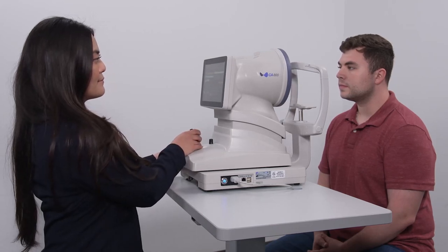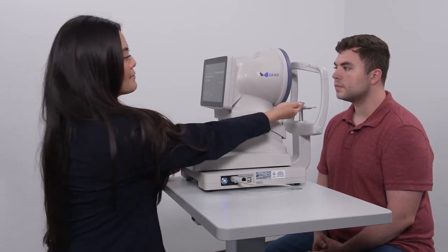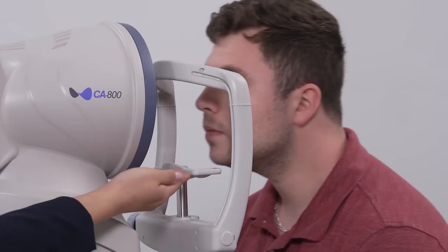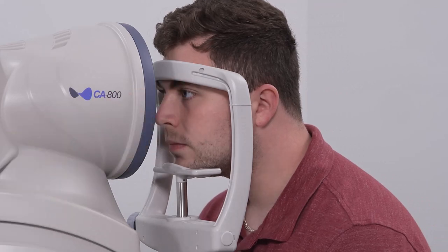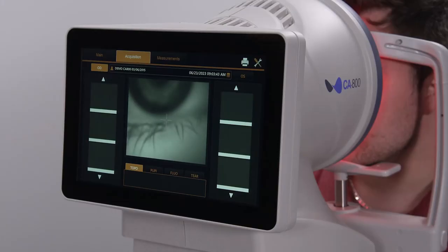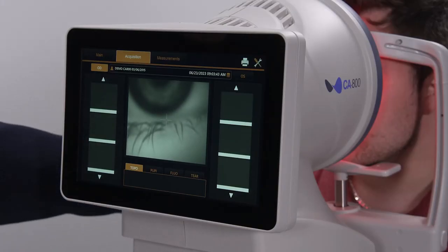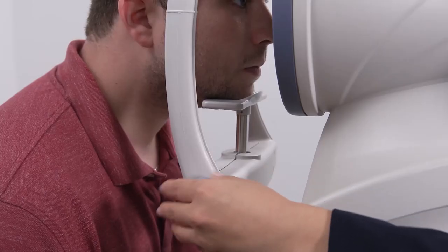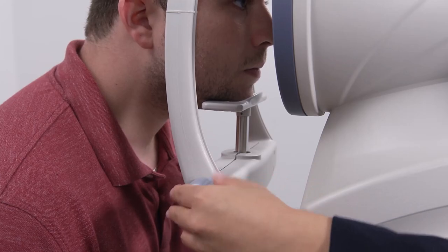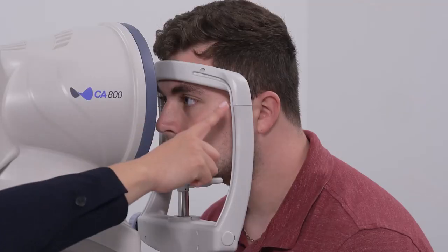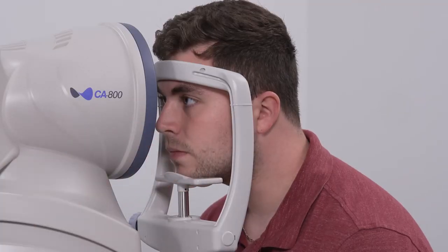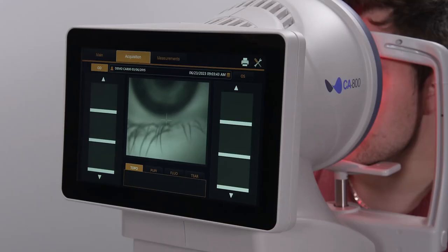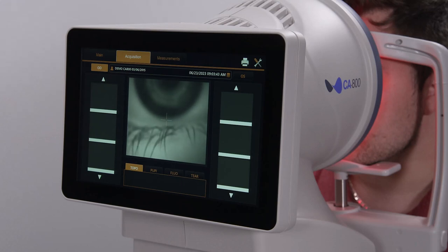Position the patient so they have their chin down and forward in the chin rest and their forehead forward against the forehead rest. For this particular test, adjust the chin rest height so the lower eyelid of the eye is aligned with the canthus marker. Adjust the table height as necessary for the patient's back and neck comfort.